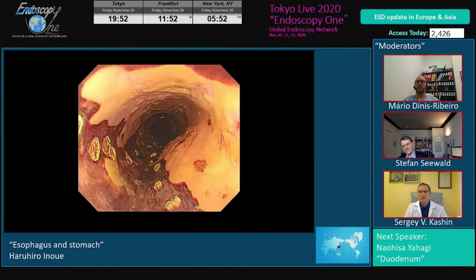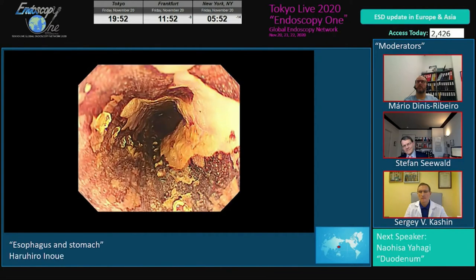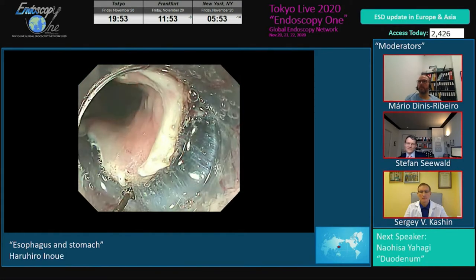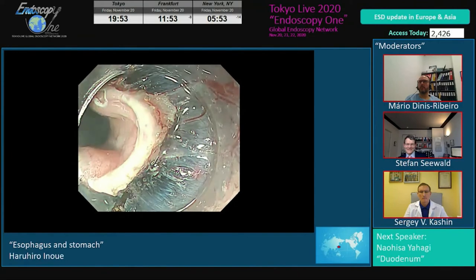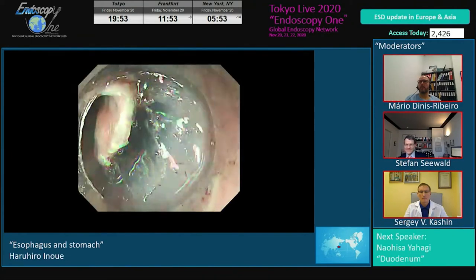So this is another case. The lesion spreads semi-circumferentially in the esophagus. In this case, we first place the circumferential mucosal incision. Now we are dissecting the submucosa using spray coagulation.